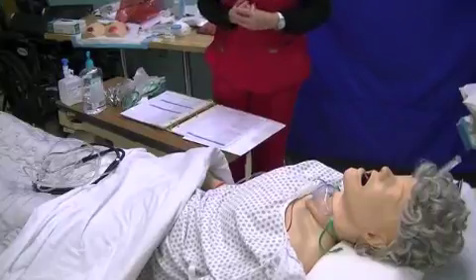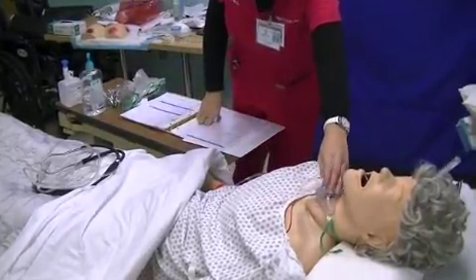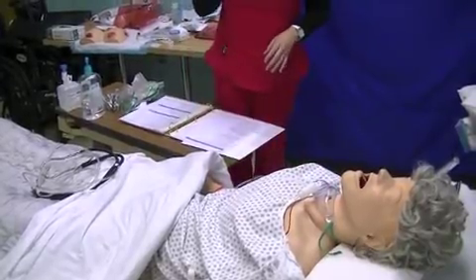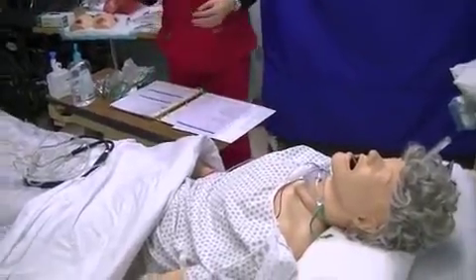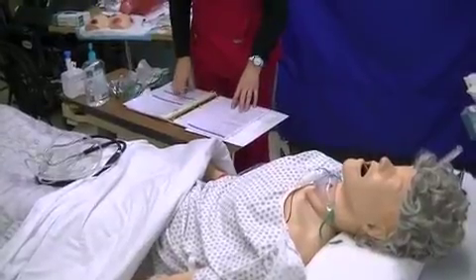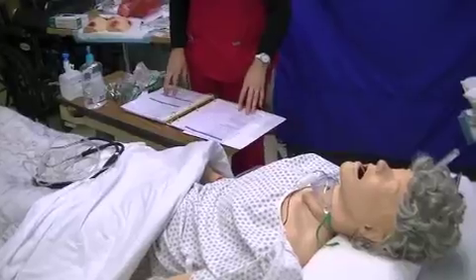So, Mr. Pierce, you're going to be using oxygen at home. And by the way, this other mask that's on here, that you'll learn later on, is a trach mask. This is for patients that have an incision into the trachea that helps to deliver the oxygen. But you'll learn that later on in a different semester. We want to make sure, if they have any questions about oxygen therapy, we answer their questions.